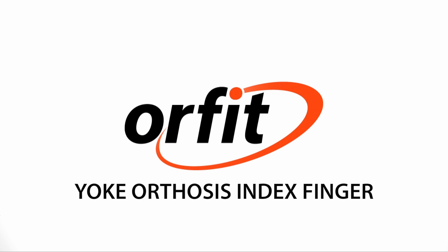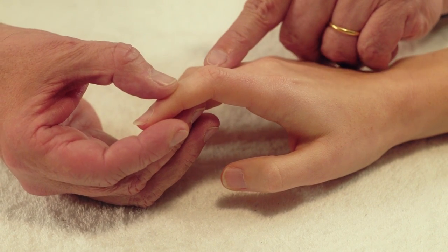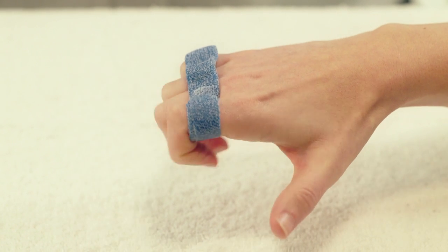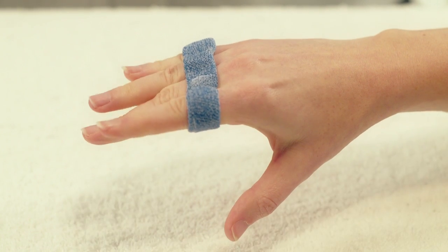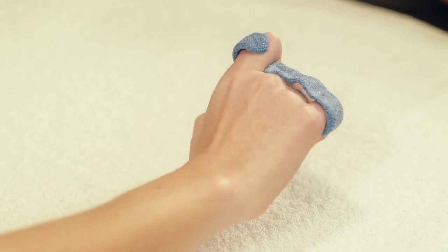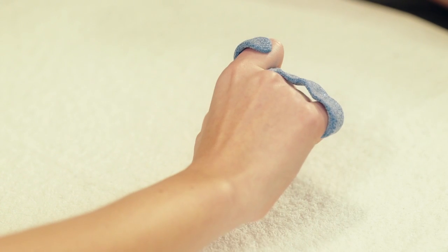Yoke Orthosis Index Finger. Here we will demonstrate a yoke orthosis for the index finger. This orthosis can be used in a post-operative extensor tendon rehabilitation protocol. It can also be used to restrict motion of one PIP joint and to encourage motion at another PIP joint.